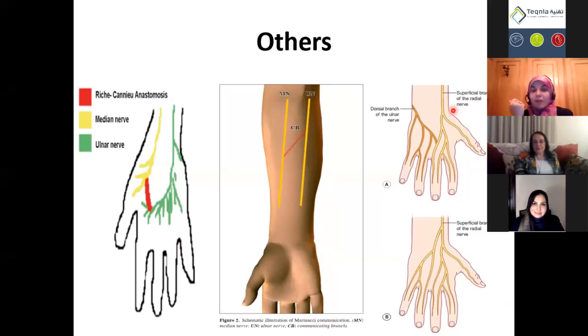He didn't get it at once, from the first time. And as if he was programmed, he just said, well, there is an anomalous innervation. It can be the superficial radial. So he took the stimulator to the superficial radial, and he didn't find anything from the superficial radial. So he returned back to the dorsal ulnar, and he improved all the technique. He cleaned and averaged and increased the stimulus duration, and he found the response. So he did everything which the lecture is about. So it is very important to master these things.